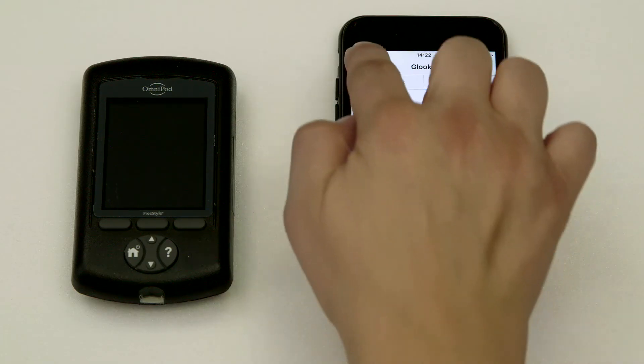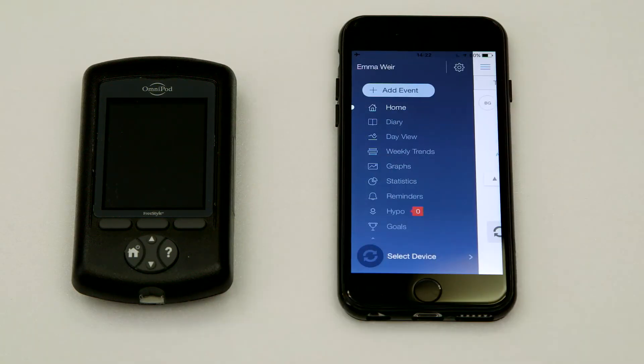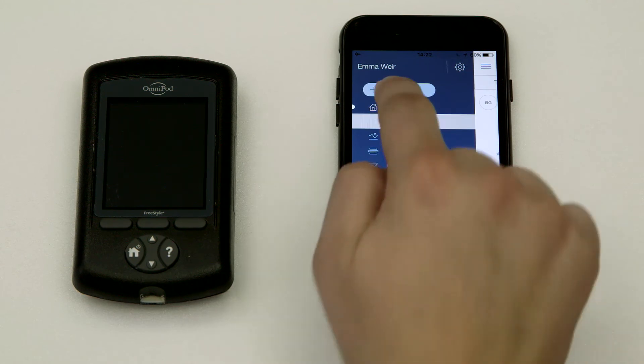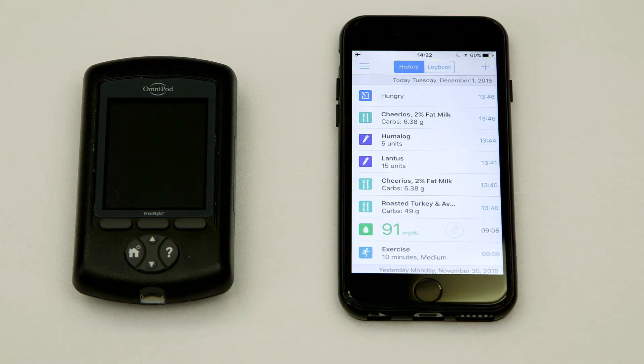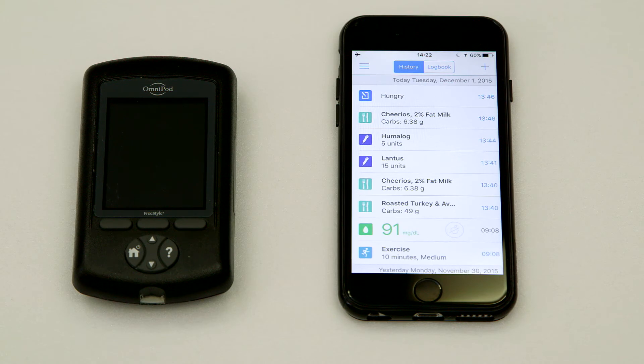From the side menu, tap the diary to see a logbook entry of your insulin, carb, and blood glucose information.